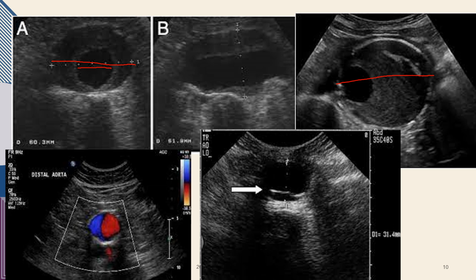When we're looking at the transverse aorta, just following it down in transverse, and you see something like this, where you see some red, some blue, this would be indicative that there is either a big dilatation of the area where the normal blood flow is coming forward, but because the dilatation allows some turbulence, you get this backflow of blood as well. So this would indicate that there is typically an aneurysm in that area, or it could be indicative of a dissection. So this could indicate that this is the true lumen, and then blood is flowing into the false lumen, getting trapped there.